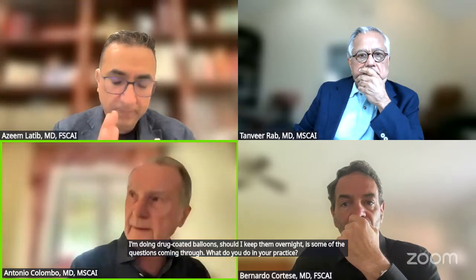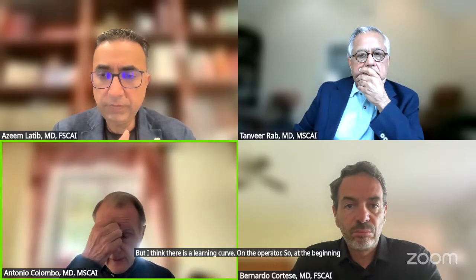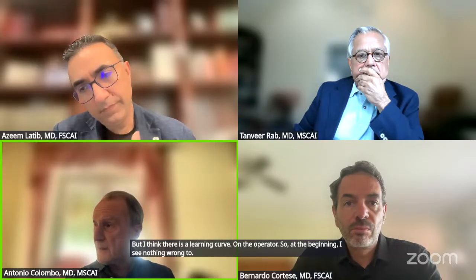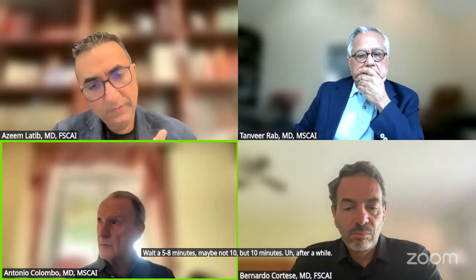But I think there is a learning curve for the operator. So at the beginning, I see nothing wrong to wait 5, 8 minutes, maybe not 10, but 10 minutes. After a while, you don't need to do that.